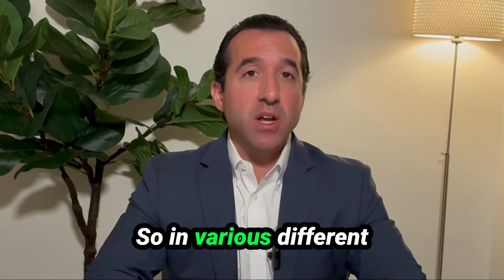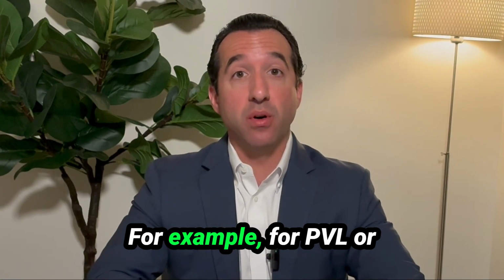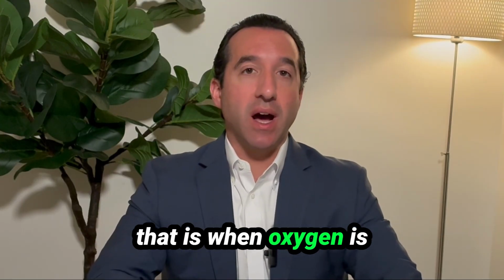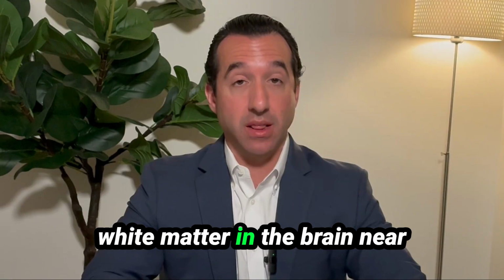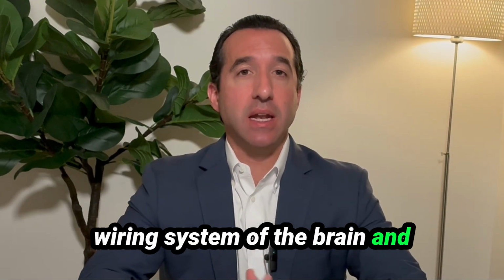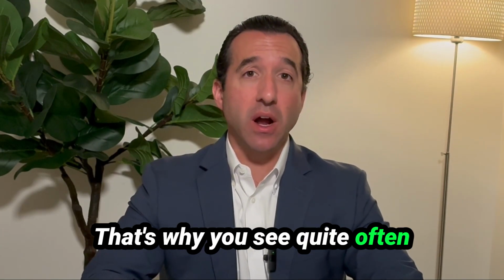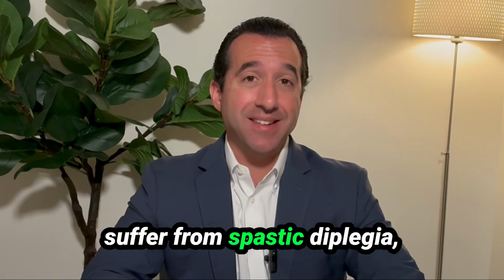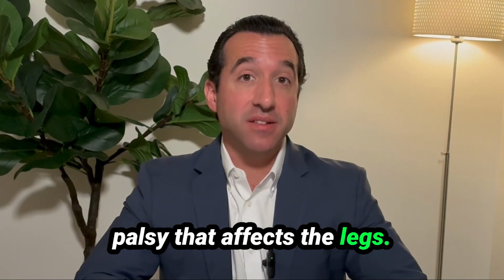So in various different ways, you will see brain injuries on MRI. For example, for PVL or Periventricular Leukomalacia. That is when oxygen is deprived of the brain and it affects various parts of the white matter in the brain near the ventricles. That affects the wiring system of the brain and does not allow a whole lot of movement or coordination. That's why you see quite often babies who developed PVL suffer from spastic diplegia, which is a type of cerebral palsy that affects the legs.